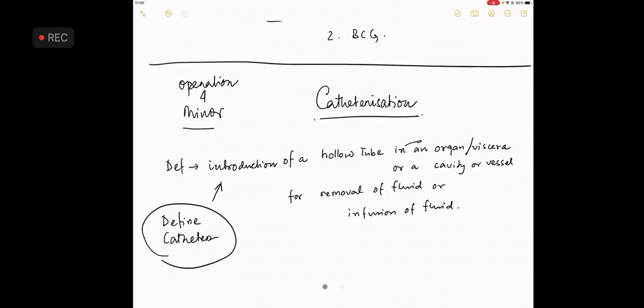That means whenever we talk about catheterization, I am going to talk about urethral catheterization only today. Catheterizations can be intravenous catheterizations, peritoneal cavity catheterizations, etc. Can you tell me when is an intravenous catheterization done? Very simple, sir. For starting an IV fluid. Okay. Can you tell me when is the peritoneal cavity catheterized? Peritoneal dialysis. Very good.